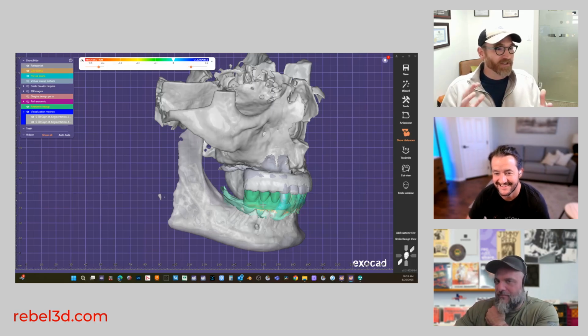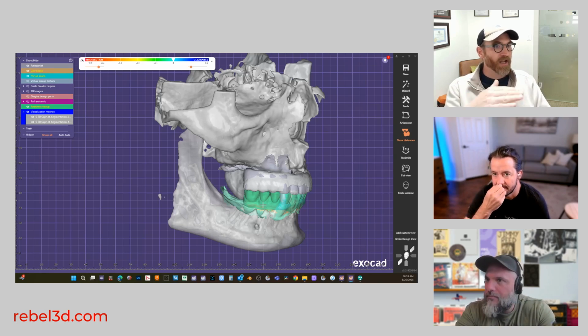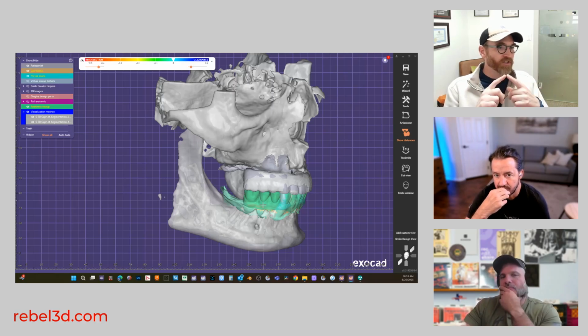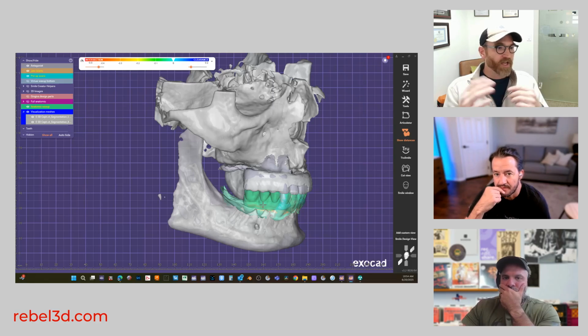And so for me, this was a good lesson, and I also had the skill to pivot quickly. So I recorded that when the bite is off, you want to scan that provisional, you want to scan the parts that haven't changed. And that's what you're going to use to realign to get your bite correct. So I'll show you the presentation, like how he presented in the delivery, what I did immediately to get him comfortable, and then I'll show you the pivot, the provisional that I delivered within a few days, and reinserted the bites, and nailed.